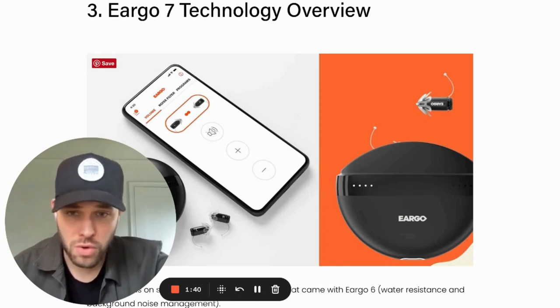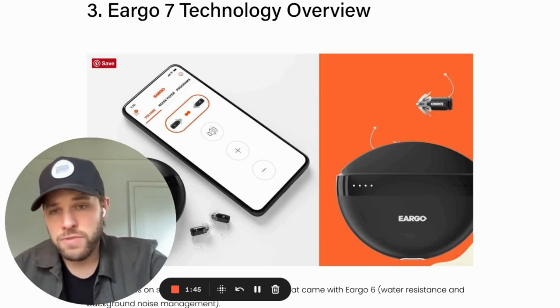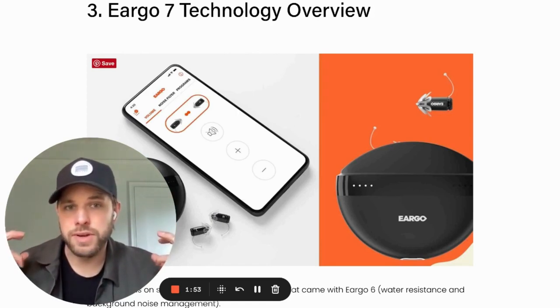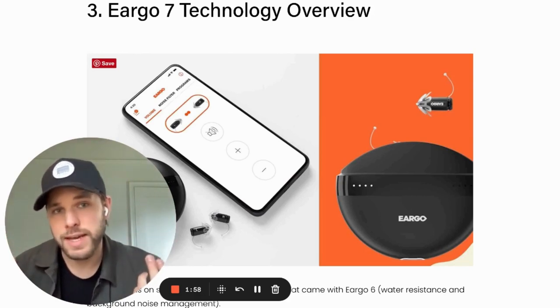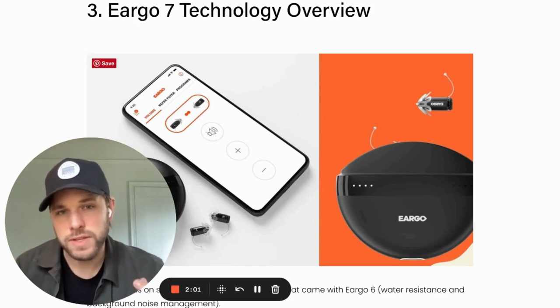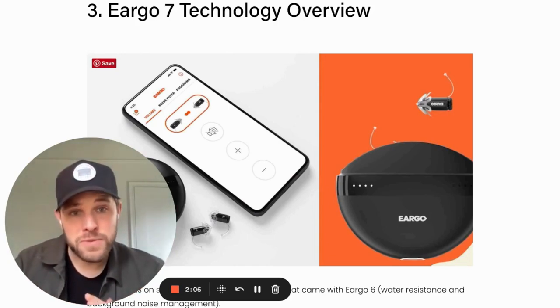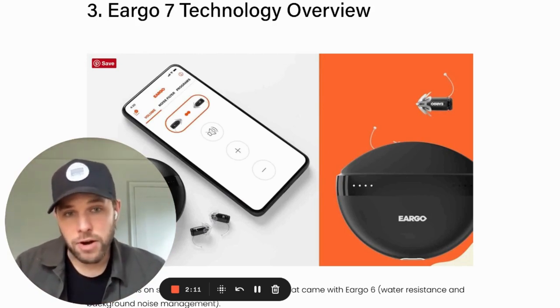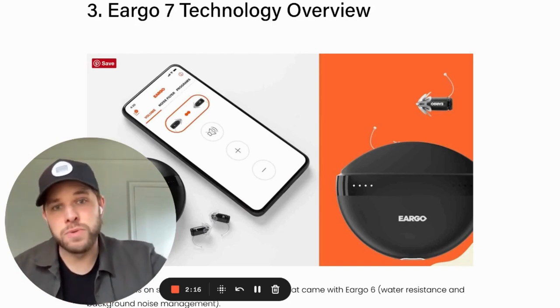The form factor is totally unique. As you can see in the image, the Eargo form factor is an invisible hearing aid. It rests in your ear with these little ear tips that sort of float the product in your ear, giving you an open-air sound quality while wearing it. It doesn't give you an occluded feeling or the boominess of your own voice. It's also rechargeable — the smallest rechargeable product by far on the market, and invisible with a nice open fit.